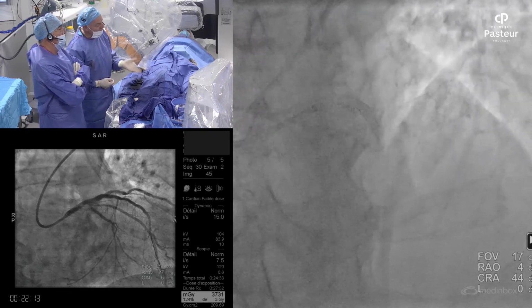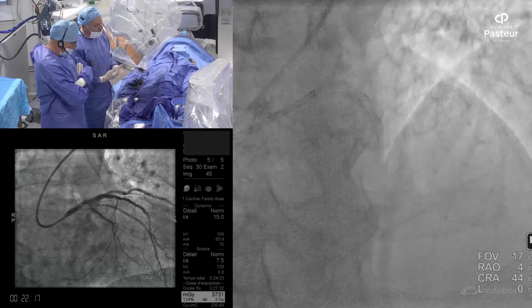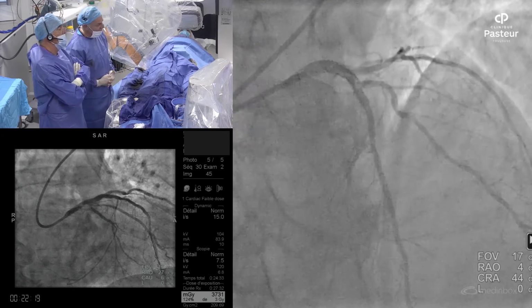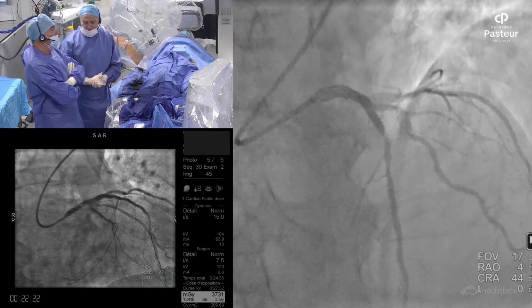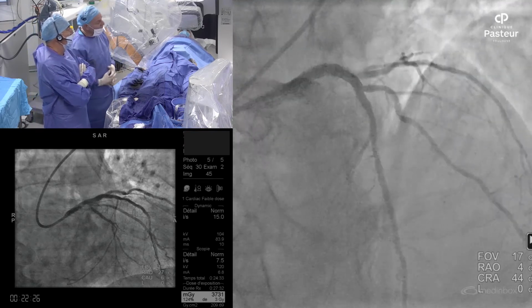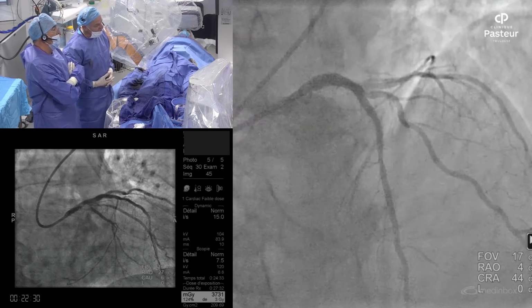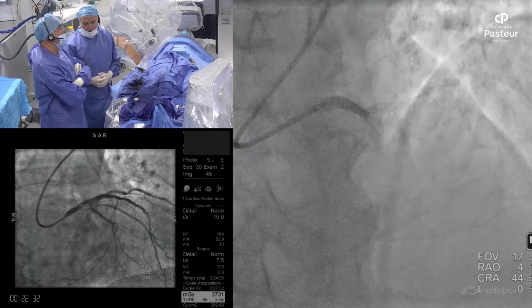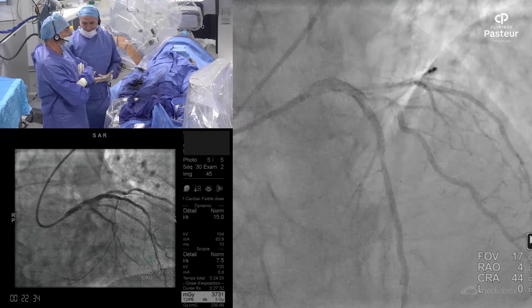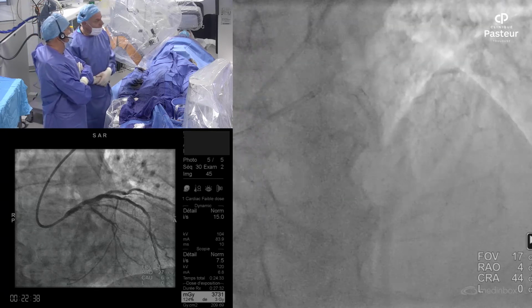This demonstrates only some apical ischemia. It was not clear just by the thallium scintigraphy that we have to treat the left main, but I think that the OCT image was quite demonstrating. So the third step was to treat the left main with the standard provisional strategy and doing a POT with a quite large balloon at the left end of the left main. And the final angiographic result was quite good.